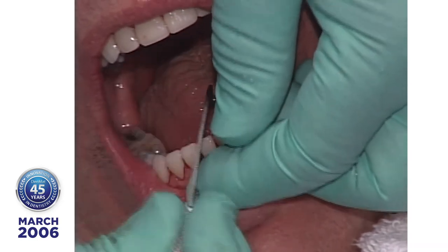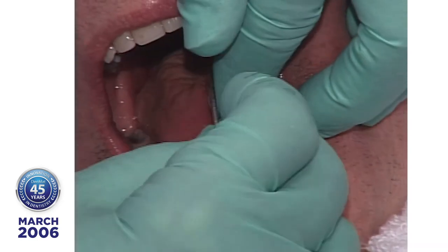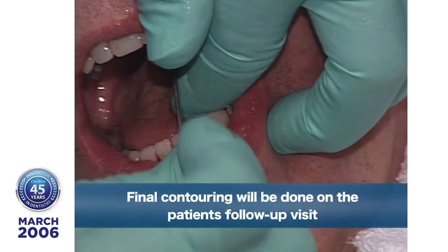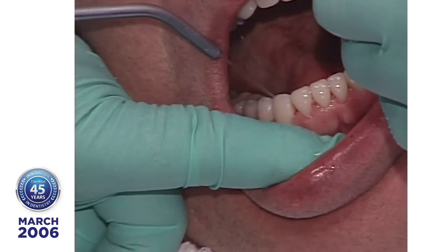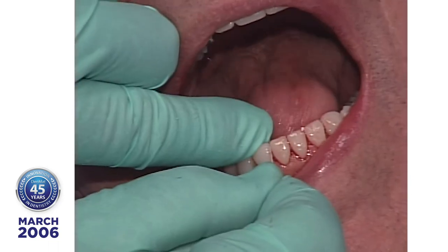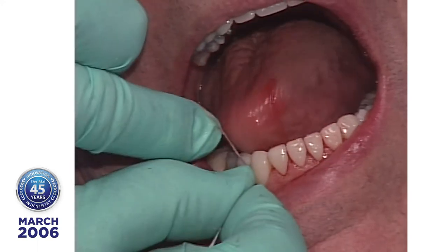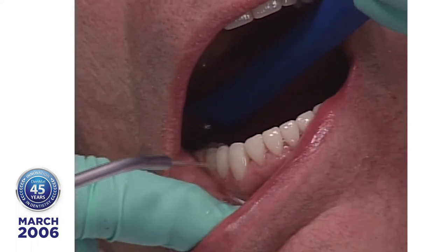So once we got that little bit in there, what I like to do, if I have too much force, is just wait and do them on a follow-up visit. But these have so much taper to them that it still works out pretty good.